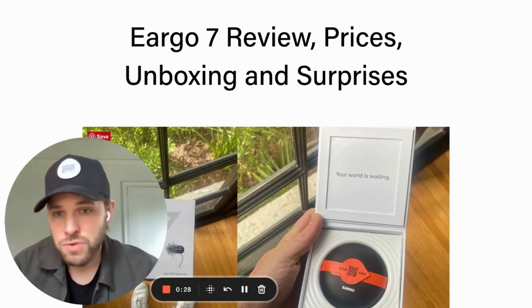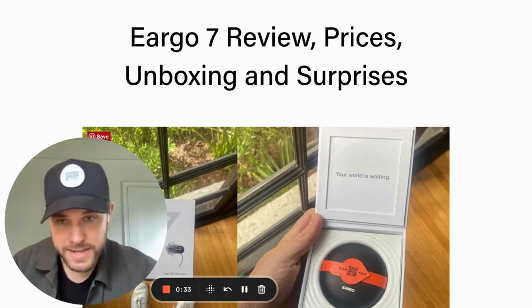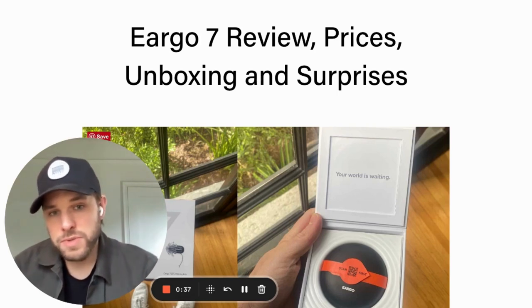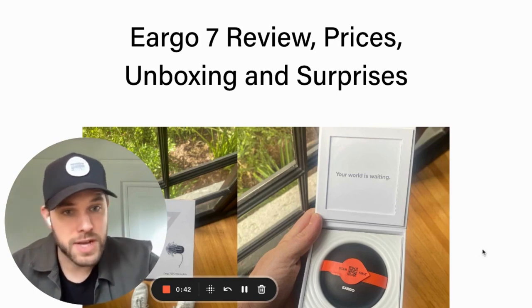I've had a chance to review the last three generations of Eargo products — I tried five, six, and seven most recently. I want to share this new experience with you, share what some of the updates are and what you can expect if you're considering Eargo for the first time.